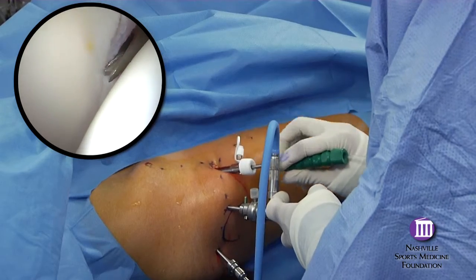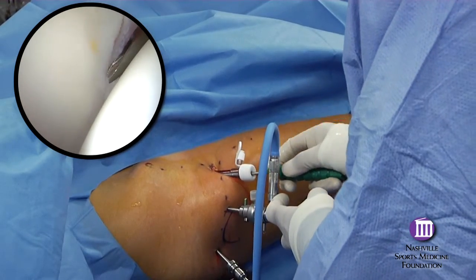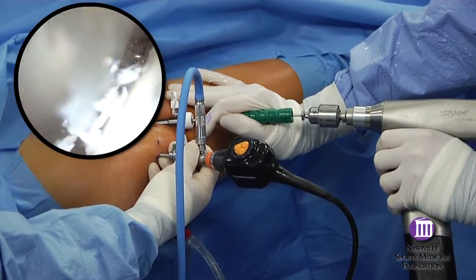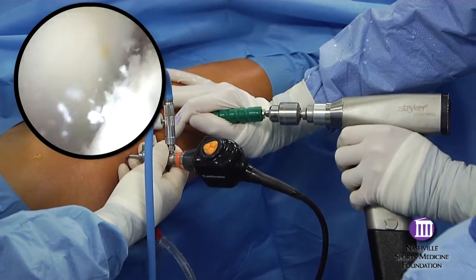For many cases, a far medial anchor can be placed from the anterior portal. The biggest concern is simply to avoid perforating the articular surface of the acetabulum.